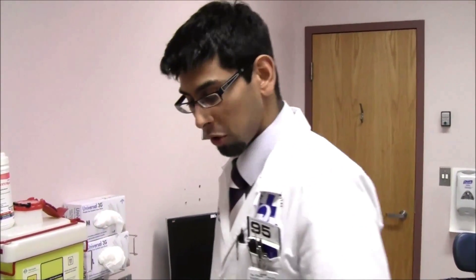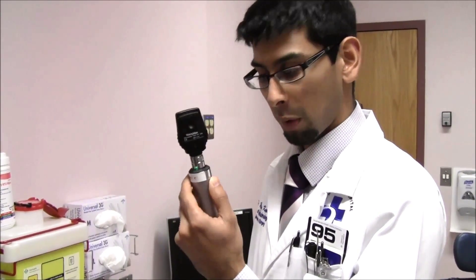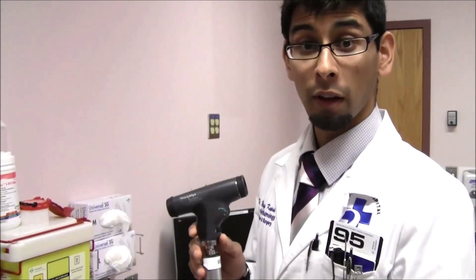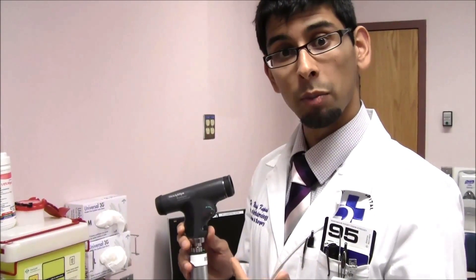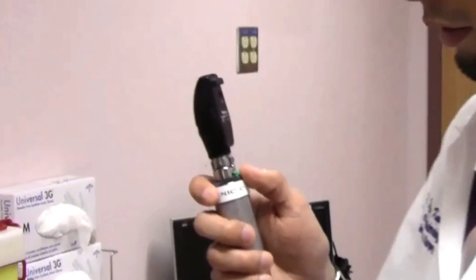Hi, my name is Dr. Capassi. I'm going to show you how to use a direct ophthalmoscope to do a retinal exam. The two kinds that you'll see in the emergency room: one is the direct ophthalmoscope from Welch Allyn, that's the model we have here, and the other is the panoptic ophthalmoscope from Welch Allyn, which is the preferred model I like using, which I'll also show you how to use. First, we're going to start with the regular direct ophthalmoscope.